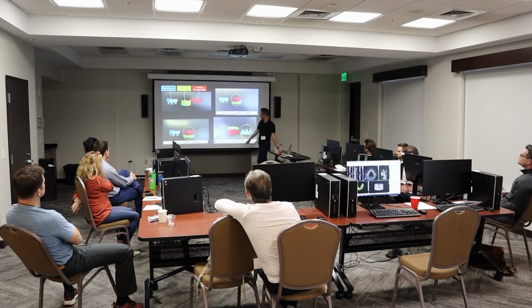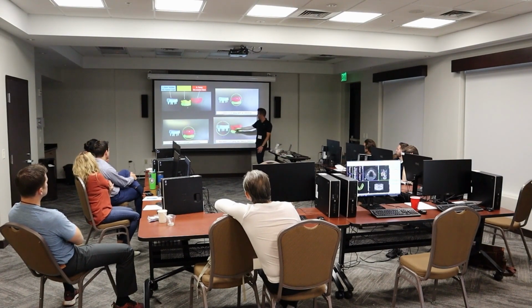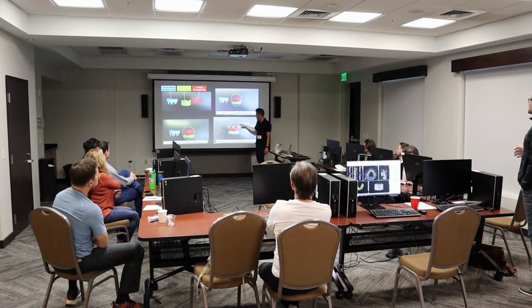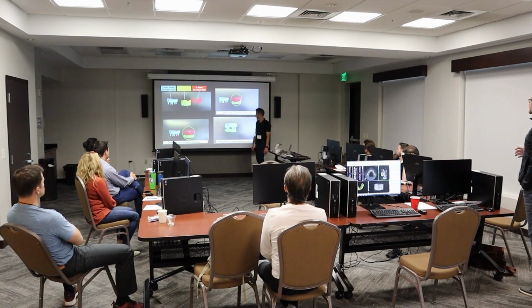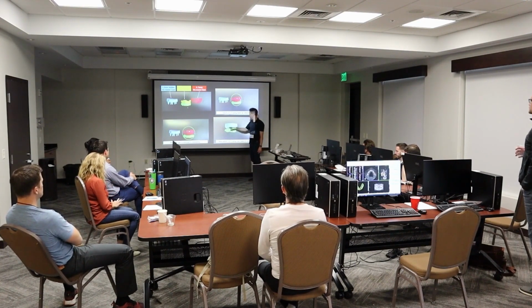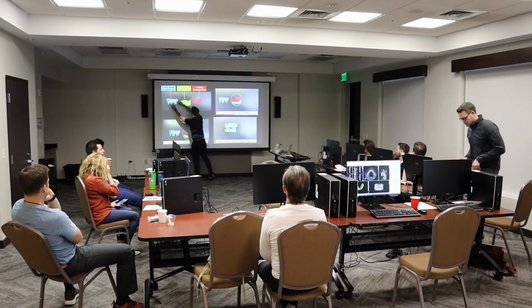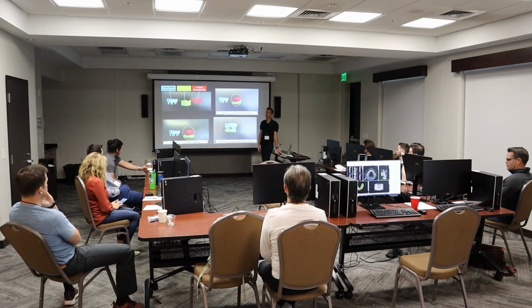Now the last one is, we're going to stitch 1, 2, 3. So the blue is going to go to the red now. So now this blue one goes onto the red one. And the whole point of that was to get to that. Does everyone kind of follow? The whole point of this whole process was to get the master cast with the implant positions in a bite reference to the lower arch. Good? So this went to this, and then this went to the red one. Does everyone kind of follow that? That's why we need those 3 scans.